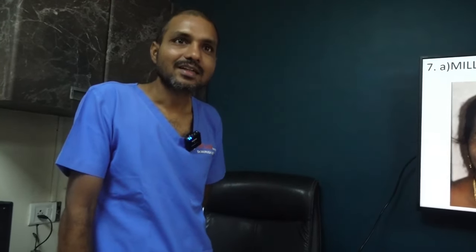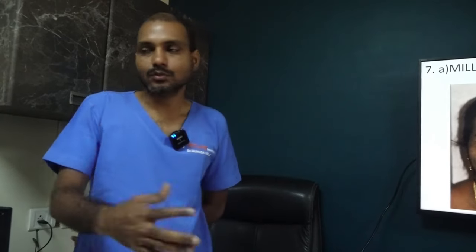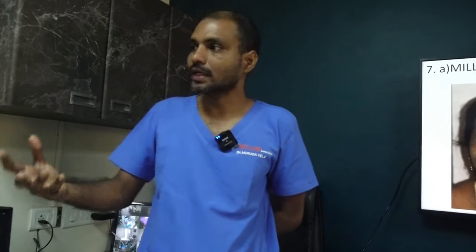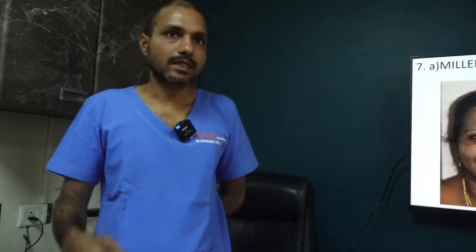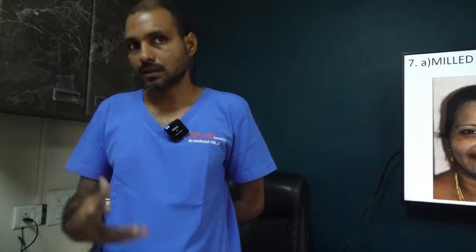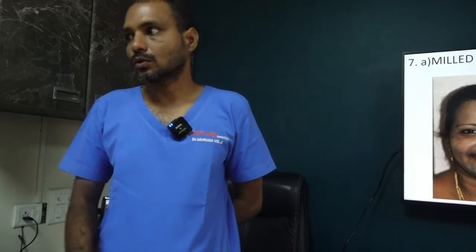When it comes to milling, it is the milling dust. When it comes to printing, it is the chemical vapor. So both are not good, right? At least the milling dust is preventable. You do proper suctioning and keep the area clean. But printing vapor, you cannot control.